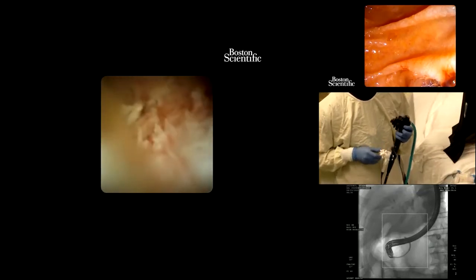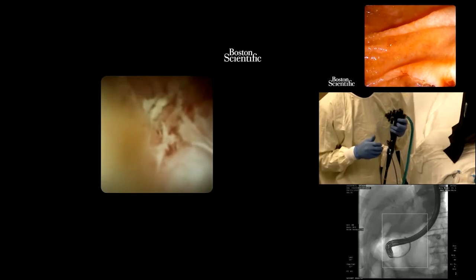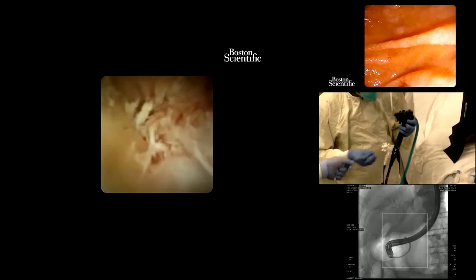If it looks very good, we might stop after another pass. And if the quantity is suboptimal, we'll perform more biopsies. If our biopsy is still suboptimal, then there's possibly a need for performing a dilation of the stricture to let us go more proximal into the ductal system to perform more biopsies. But the fact that I can see a viable tumor here makes me feel that I don't have to perform a dilation. I should be able to get high quality tissue just because this looks really vegetative and ulcerated.